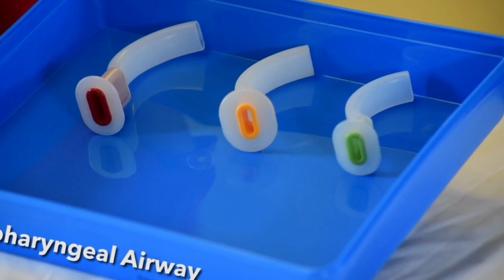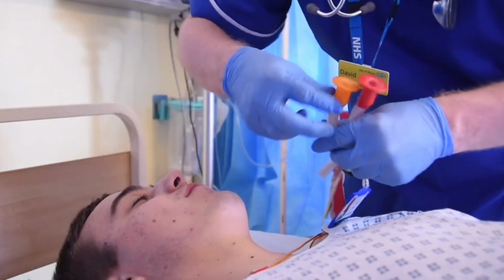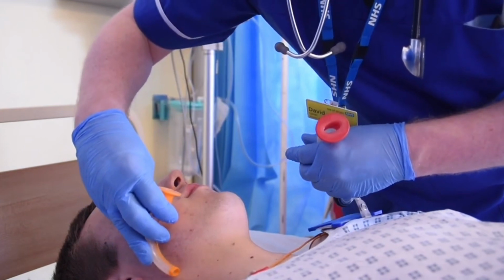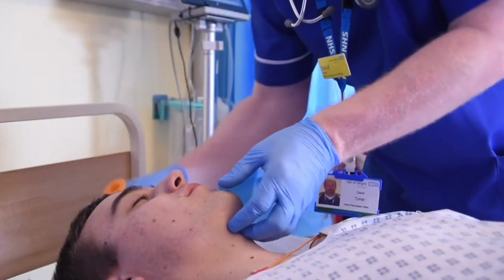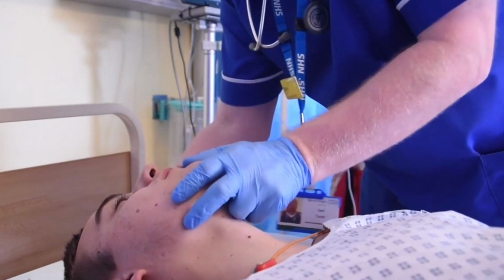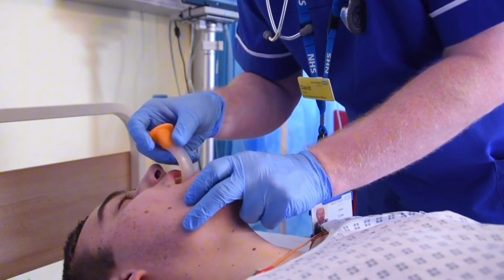The OPA is color-coded by size for easy reference, but still needs to be sized using a simple assessment to ensure good fit. The airway is placed along the unconscious patient's face, and the length assessed from the corner of the jaw to the level of the incisor. A well-fitted airway will conform roughly to this length, with one slightly too large being preferable to one slightly too small. An airway that is too small will not keep the tongue from falling back. If the measurement appears to fall between two sizes, favor the larger size.